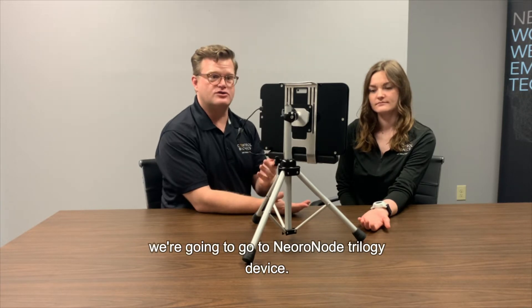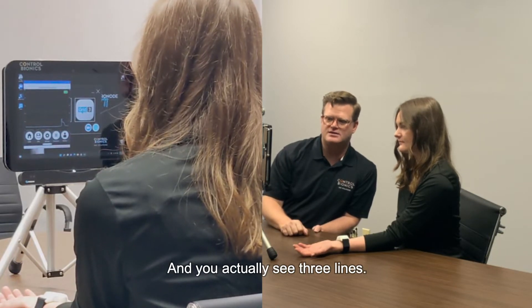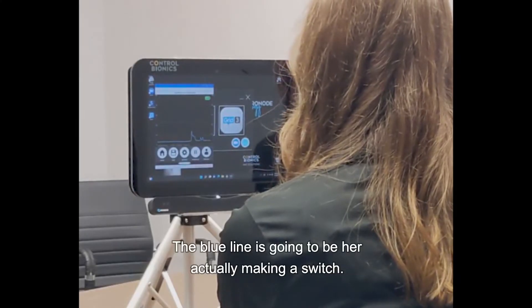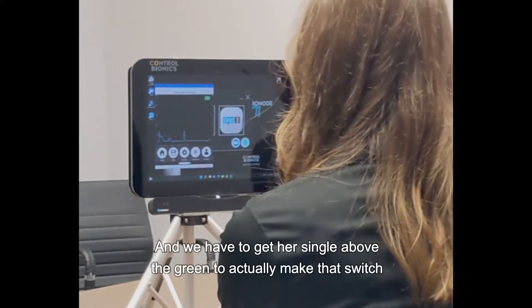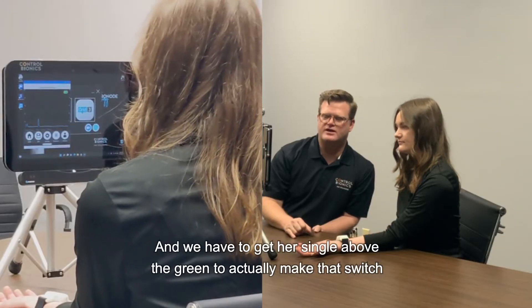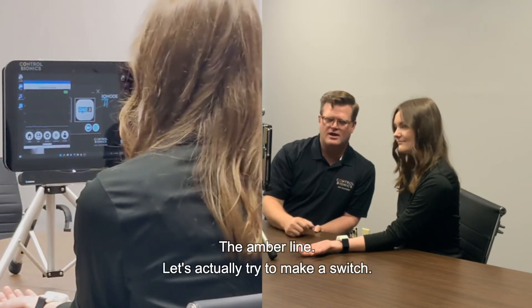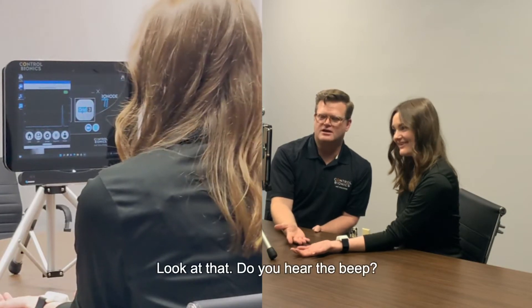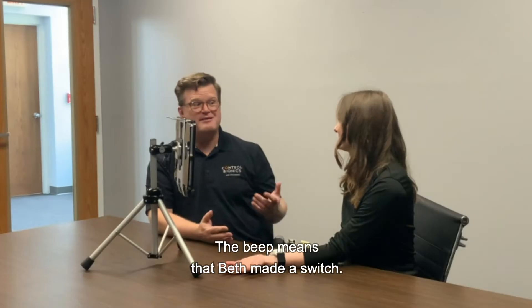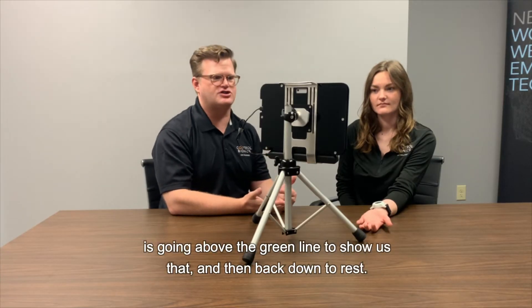To do that, we're going to go to the NeuroNode Trilogy device, hit the play button, and you'll see three lines. The blue line is going to be her actually making a switch. The amber line is going to be her at rest. And we have to get her signal above the green line to actually make that switch. We can see she's at rest because the blue line is below the amber line. Let's try to make a switch. Perfect — do you hear the beep? The beep means that Beth made a switch. On the graph, we can see her blue line going above the green line and then back down to rest. Let's show them a few more times.